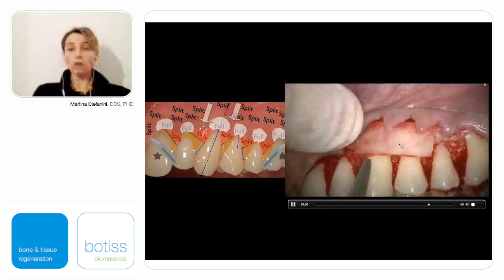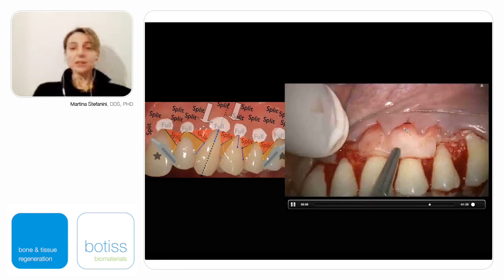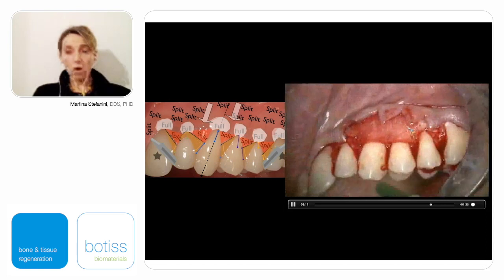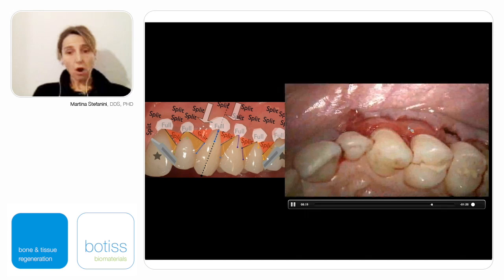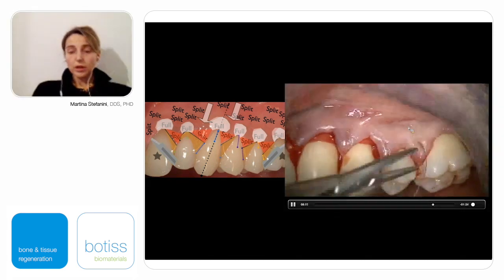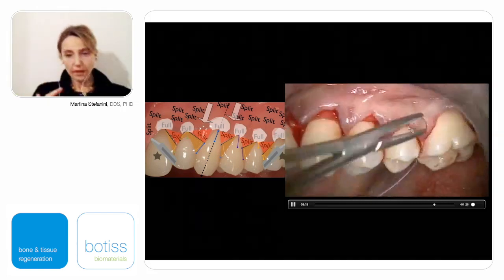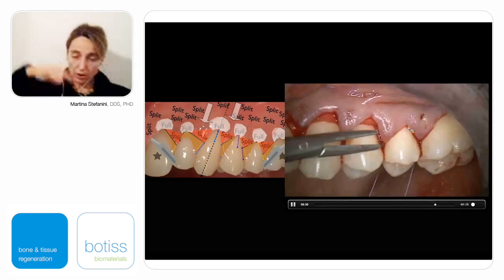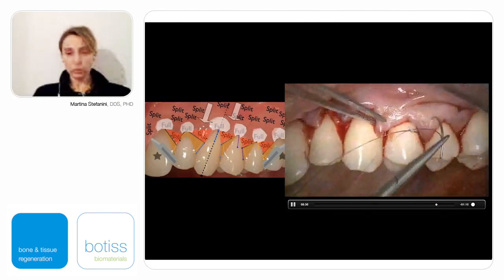The height of the mucoderm is a distance from the cemento-enamel junction to 2-3 millimeters above the bone crest, because we want to place the matrix above the bone crest in order to use the step that there is between the bone crest and the root to improve the space for the blood clot in the inner aspect of the matrix between the matrix and the root.